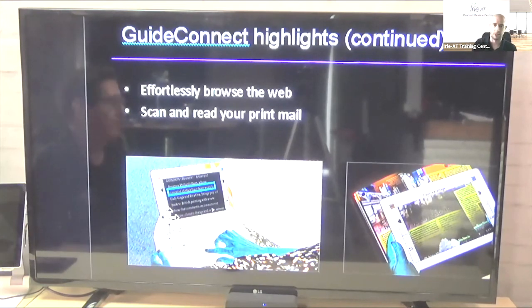For example, situational settings, like Jeff mentioned, like having a dialog box pop up in front of you. If you are magnified, let's say, at whatever magnification, and you're using full screen, and the print dialog box or save dialog box pops up, well, if you're magnified at that level, that dialog box is just going to be huge, because you're not going to be able to see it.